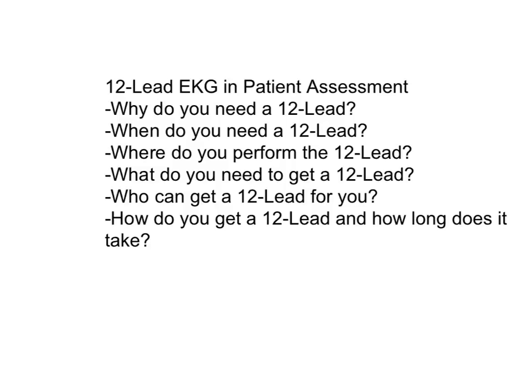When do you need to get one? Anytime you suspect cardiac ischemia, we would suggest that you get a 12-lead before you start treatment with nitroglycerin if at all possible. Sometimes nitroglycerin will relieve any changes that are on that 12-lead, and we'd like to capture that beforehand. You can do a 12-lead rapidly enough, efficiently enough that it doesn't impact your patient care, and it may actually help that patient long term to have recorded that.